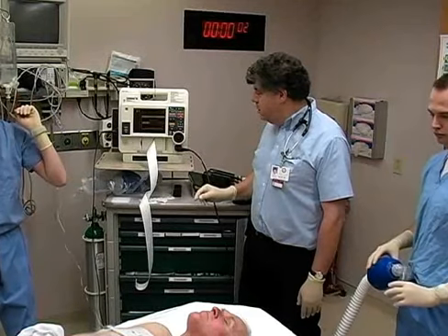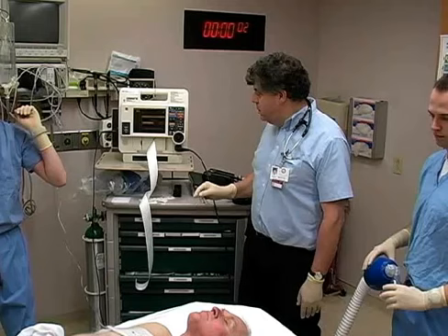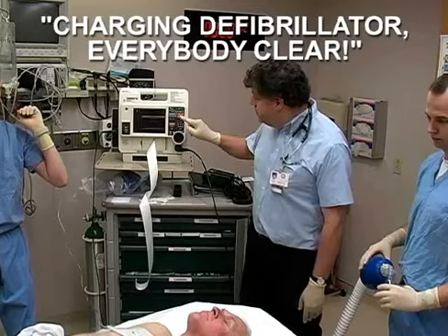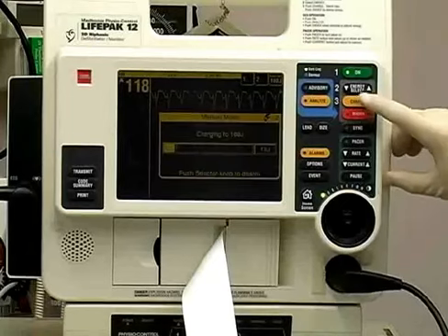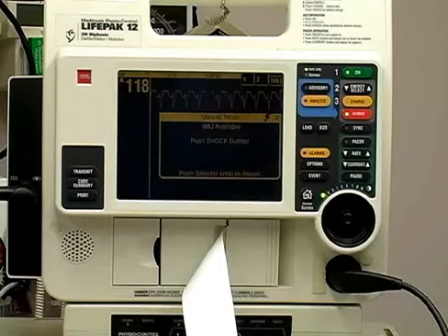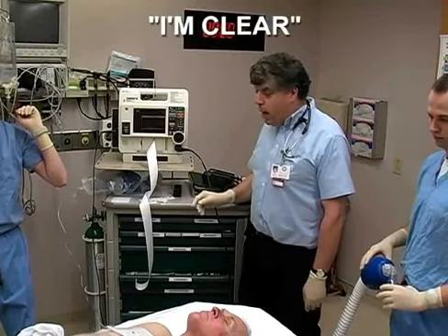Before charging the machine, it is essential to assure that no caregivers are in direct contact with the patient to avoid being shocked themselves. Firmly announce, "Charging defibrillator, everybody clear." Once everyone has stepped back from the patient, press the charge button and the defibrillator will charge to the selected energy. Once charging is complete, confirm that you are not in contact with the patient and firmly announce, "I'm clear."